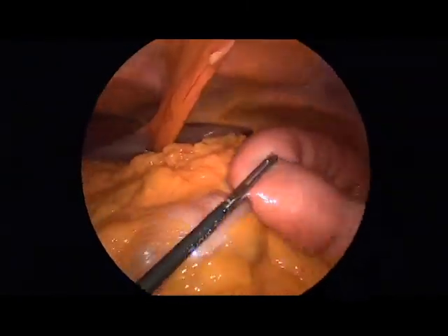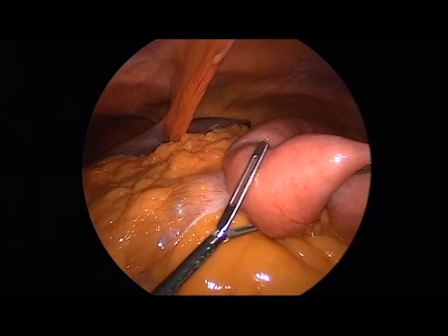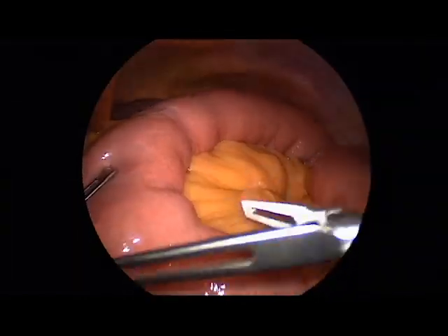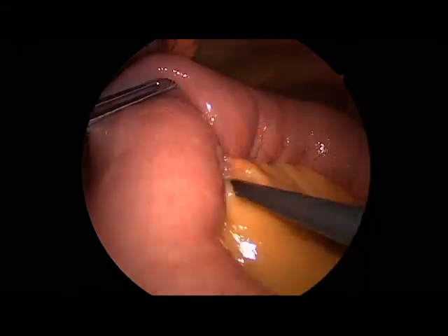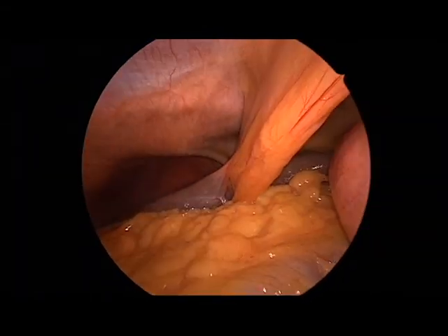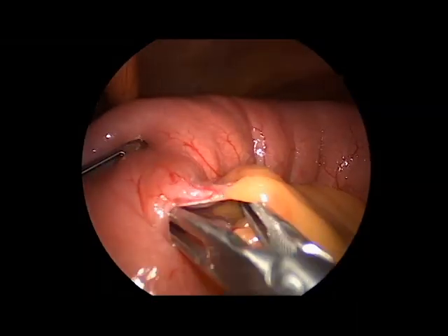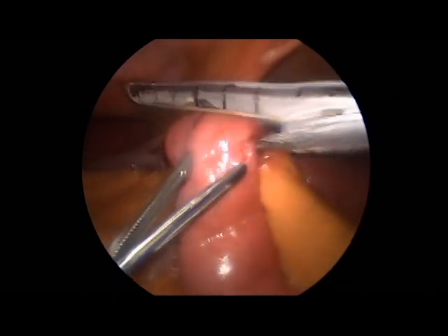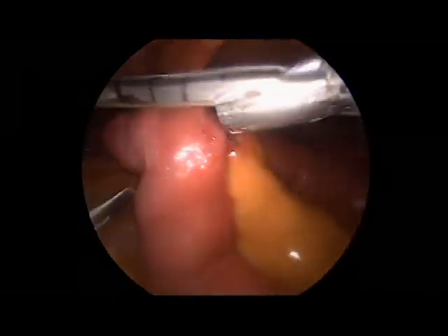The first step of the operation is to create a roux limb that will lay without tension in the supracolic compartment. Once this is confirmed, the mesentery is divided close to the bowel. The gap is widened to facilitate placement of a linear cutting stapler, which is used to divide the bowel and confirm orientation of the roux limb.